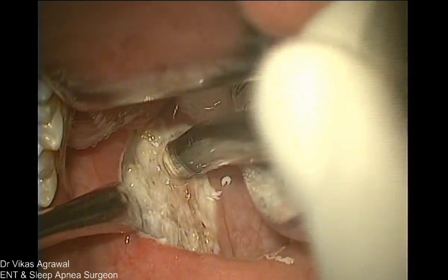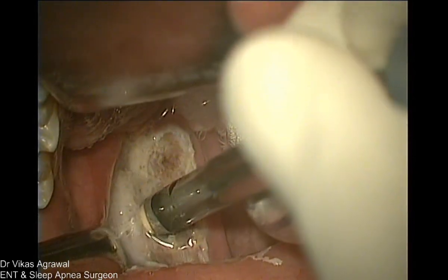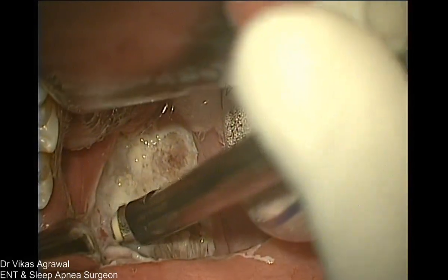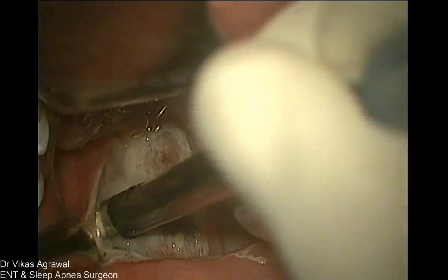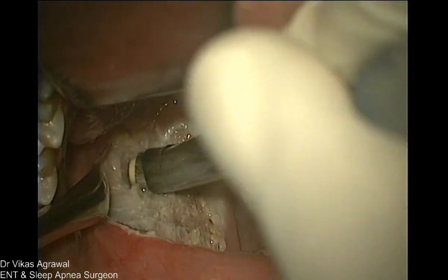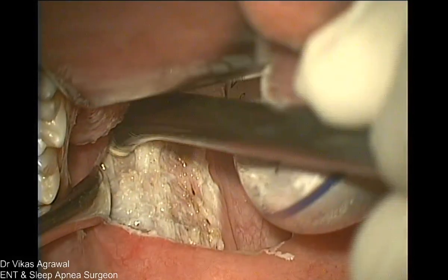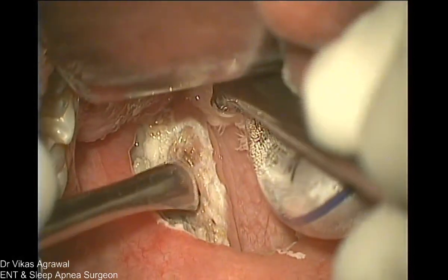So since we coagulated that, the flow in that vessel will also reduce, and I am just doing a little bit of coagulation all around, so that any small vessel which is there will coagulate and will not bleed. Tonsillar artery we have already gone and coagulated. Yeah, this was the tonsillar artery which we have already coagulated in the entire course.